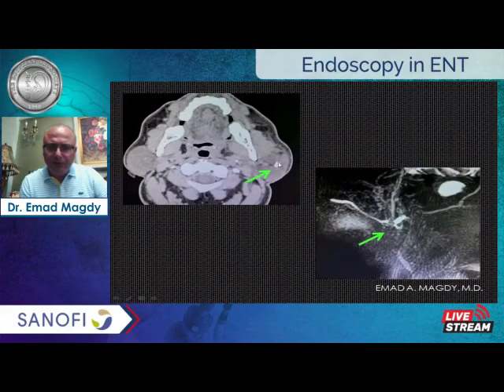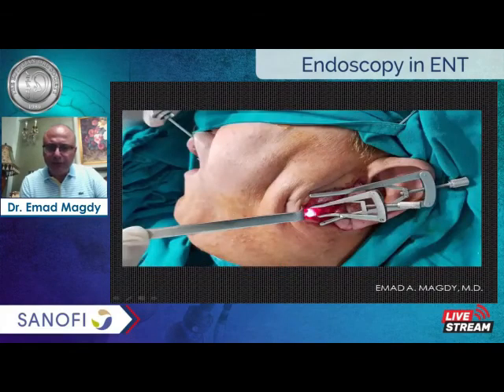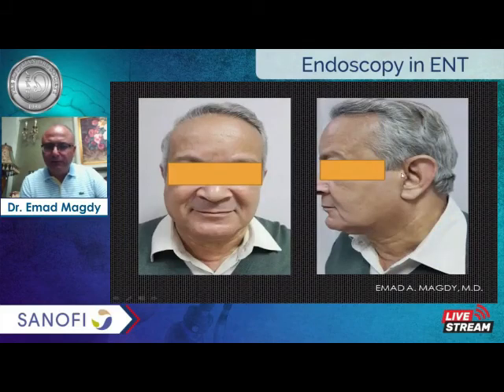Another stone, 5 millimeter, rounded stone. So this is a smaller kind of stone, again, preoperative MRI salivary. Localizing the stone with your scope. Sometimes I like to use these self-retaining retractors. They help when you're working under the operating microscope to stabilize the field after closure of the wound. And you can see here the 5 millimeter stone. So this is a smaller size stone, but rounded, which is more difficult to extract using sialendoscopy techniques only, or even for fragmentation. Patient post-operatively, barely noticeable scar.